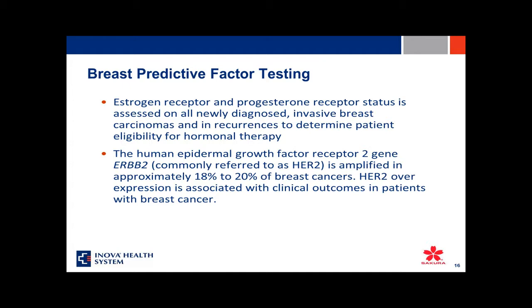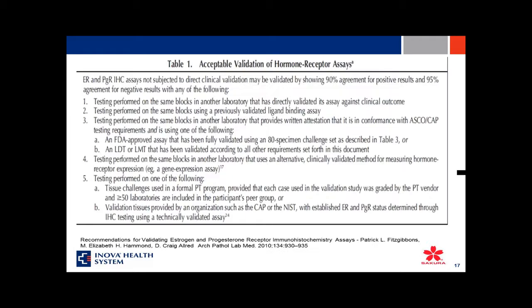These tolerance limits must be established when you are doing your validation study, and also after, when you actually put your test into clinical service. They should be a part of your QC procedures. This is actually from the CAP recommendations for validating IHC assays.